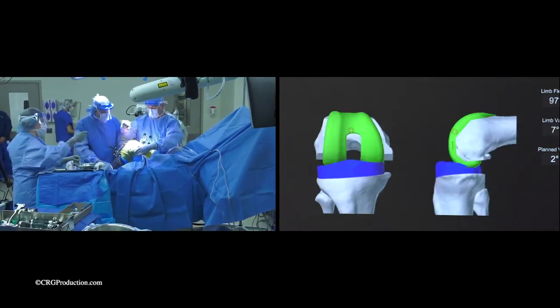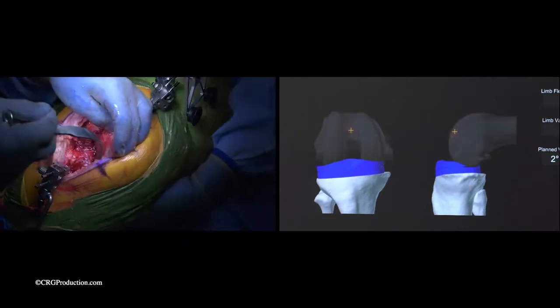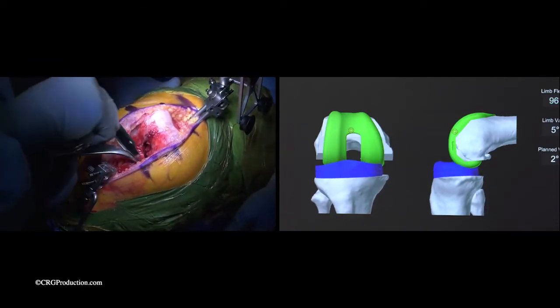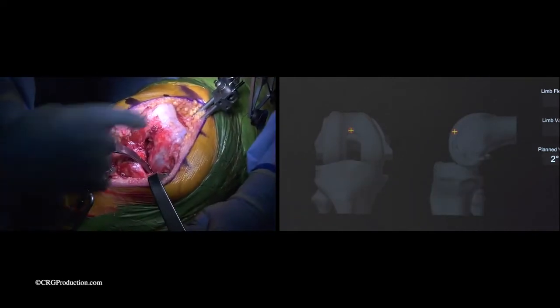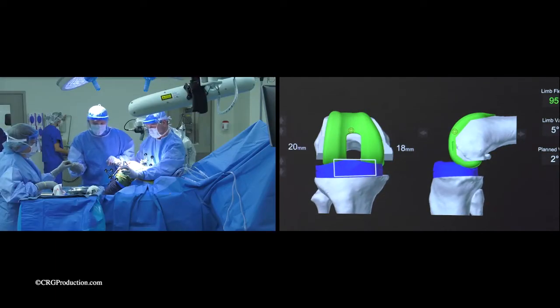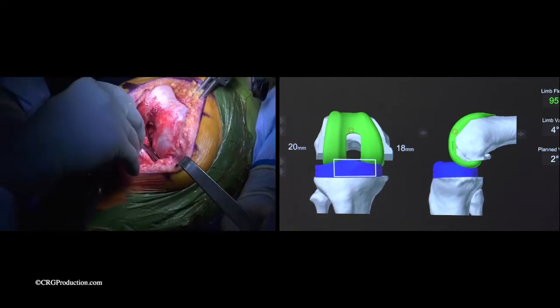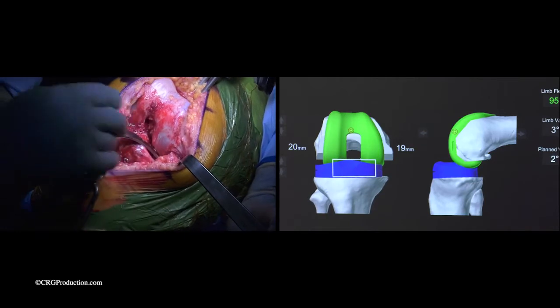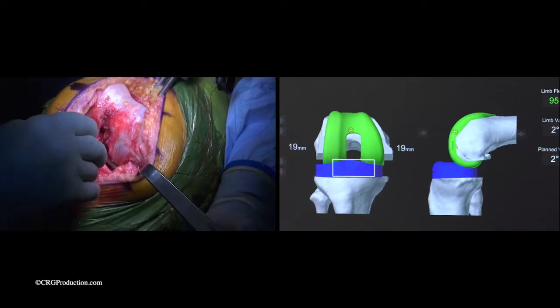This must be done both with the knee fully extended or straight, and also with the knee at 90 degrees or bent. The various tools are inserted again to stretch out the knee to check out the gaps. In this case, the ligament, the MCL, is too tight. So under direct vision, we are loosening up the ligament on the inside part of the knee and having that 18-19 number possibly come looser to 20.